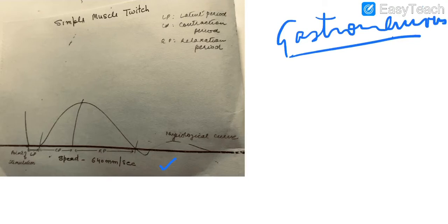and I will just come to the basic point. We take the sciatic nerve, we dissect out the sciatic nerve starting from its end point at the spinal cord. We won't cut the entry point of the sciatic nerve in the spinal cord, right? We will just cut the spinal cord above and below where the sciatic nerve enters, so it will stay intact. We will trace this sciatic nerve. It supplies the gastrocnemius muscle.